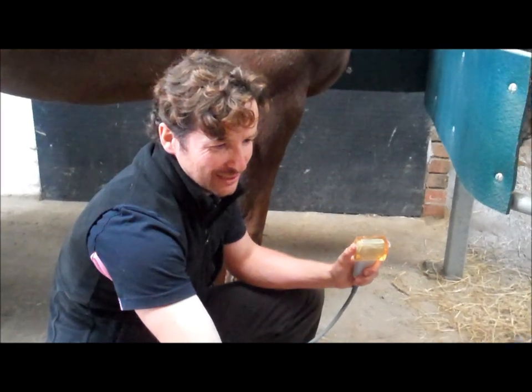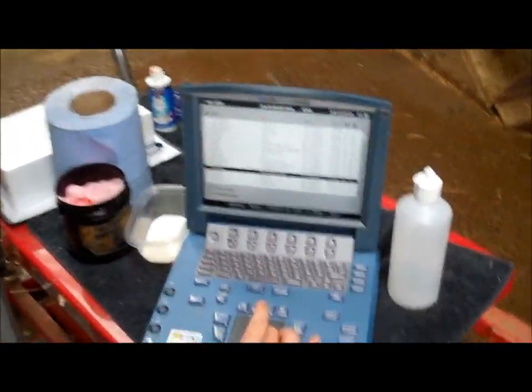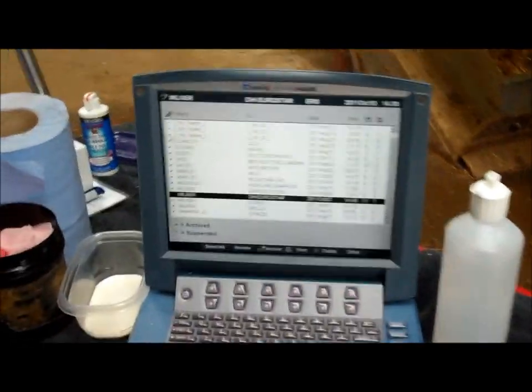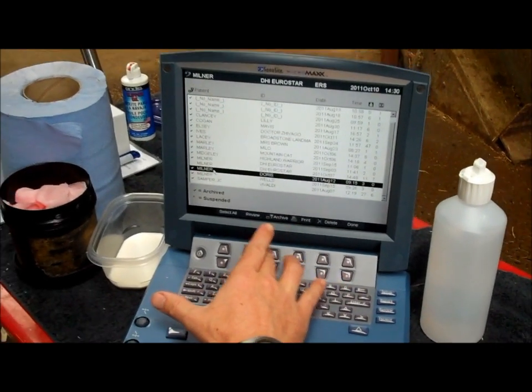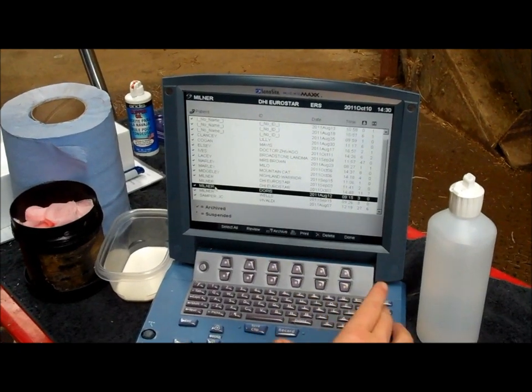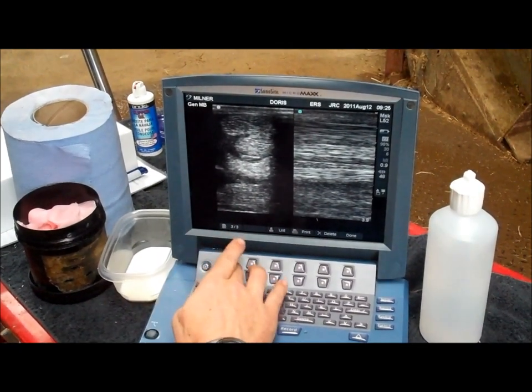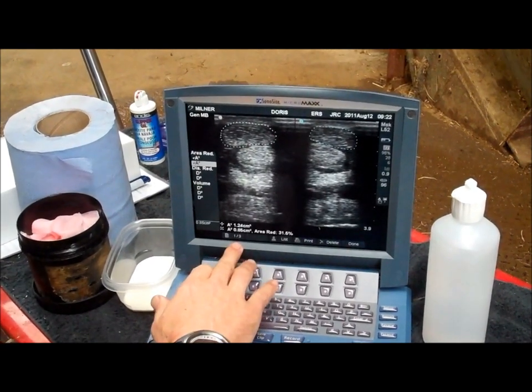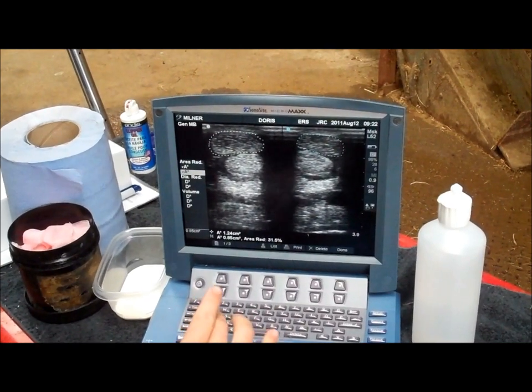What we can actually do with this scanner is look back at previous examinations, because all the scans are still on the scanner. The ticks down the side indicate that they have been archived. If I go to Milner, Doris — select — we can review that set of images from the last examination. There are three images and we can scroll through them and look at the measurements from last time. In this case the right leg was 1.24 cm.